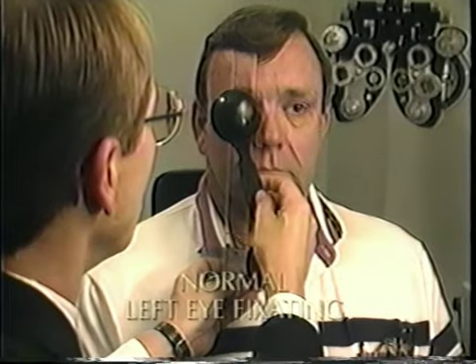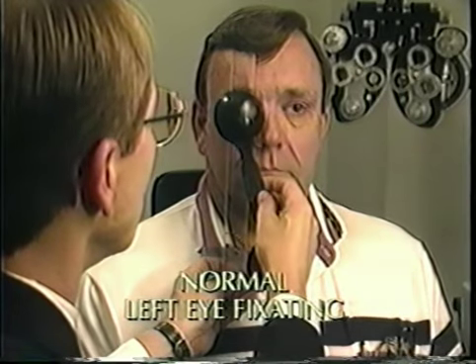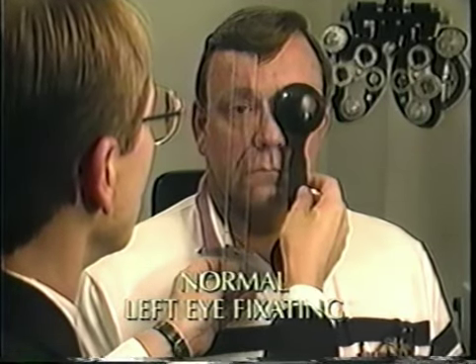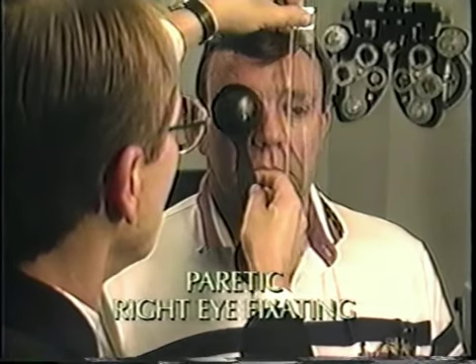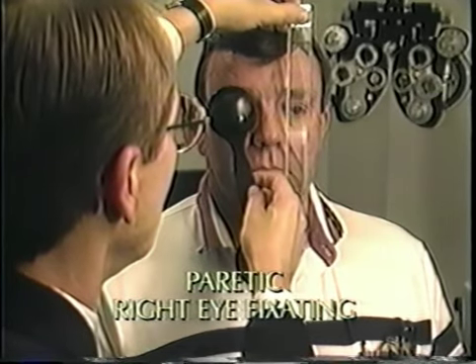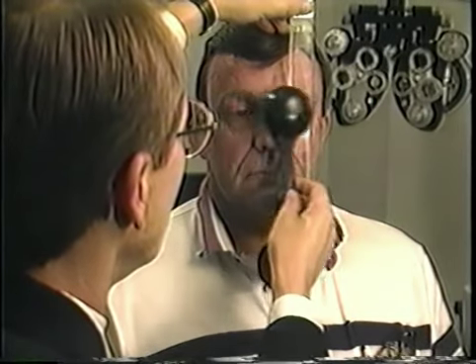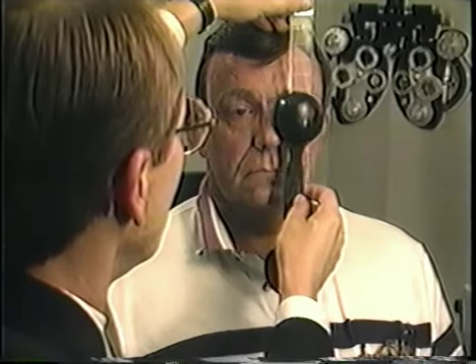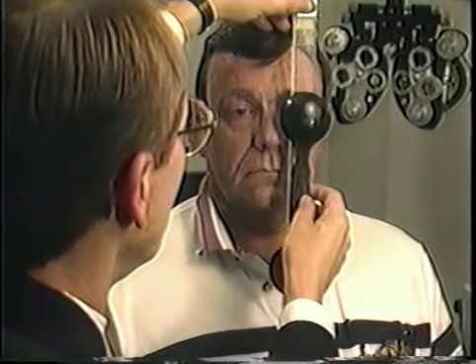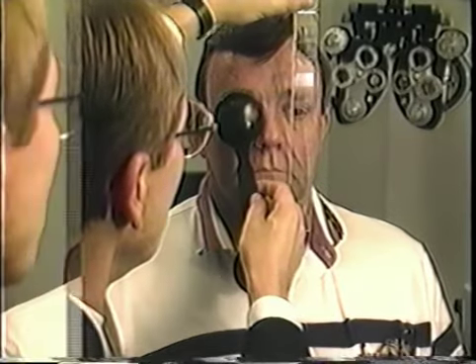This patient has a right superior oblique paresis. With the prism over the affected right eye, he fixates with the normal left eye and has a 5-prism diopter right hypertropia. With the prism over the normal left eye, he fixates with the affected right eye. Fixation with the affected eye causes a larger secondary deviation. In this instance, a 16-prism diopter left hypotropia. Placing the prism in front of the affected eye accurately quantifies the primary deviation.